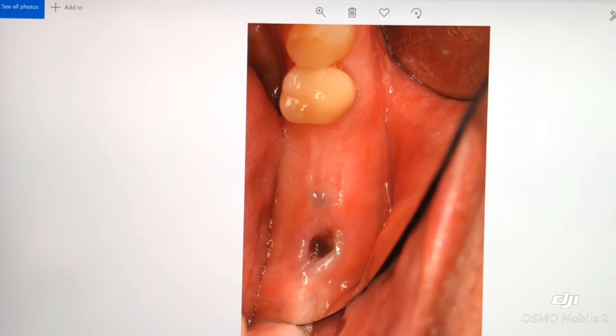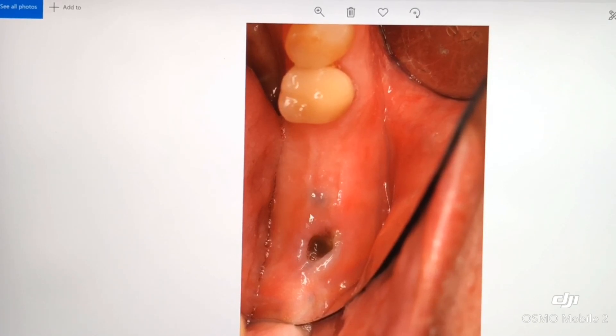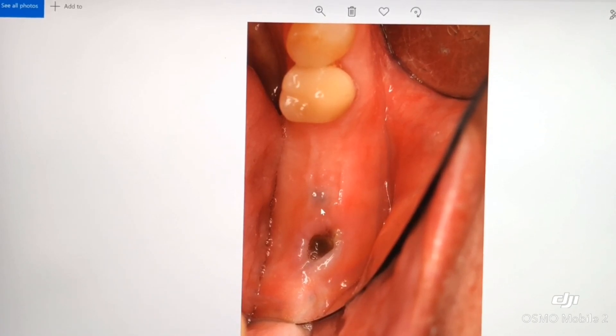It turns out that after some detective work, we discovered it was a Zimmer implant. A little titanium tattoo here.